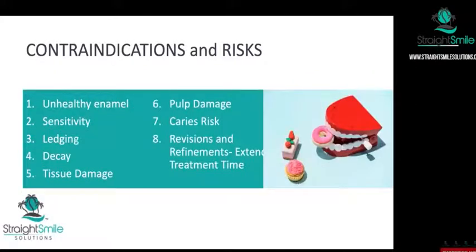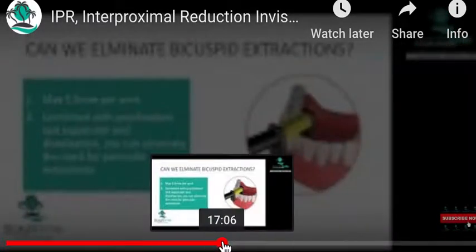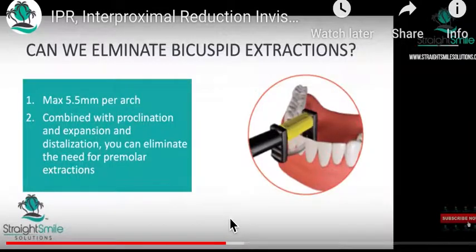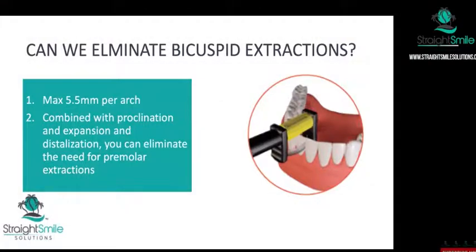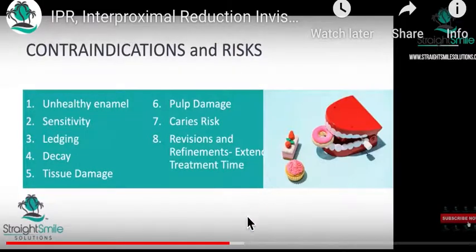I really try to recommend staying away from anything that's mechanical in nature, because unless you have a huge, really long tooth and a gigantic embrasure, the risk of ledging those teeth is high, and it can be very uncomfortable and scary for the patient as well. I really like this system because you can pre-curve it and put it on the stick. You can pre-curve it and do it when the teeth are crooked. You can use it as straight, and you don't have to pinch it to pre-curve it. This will make more sense when you watch the video. You can use it at the beginning of treatment when teeth are still crooked, and you can use it at the end of treatment. There are just a lot of different options.